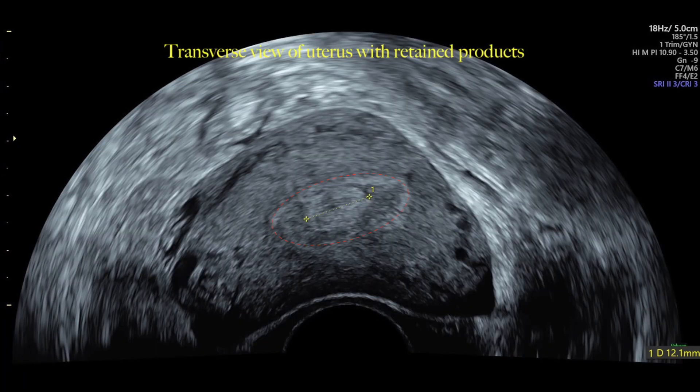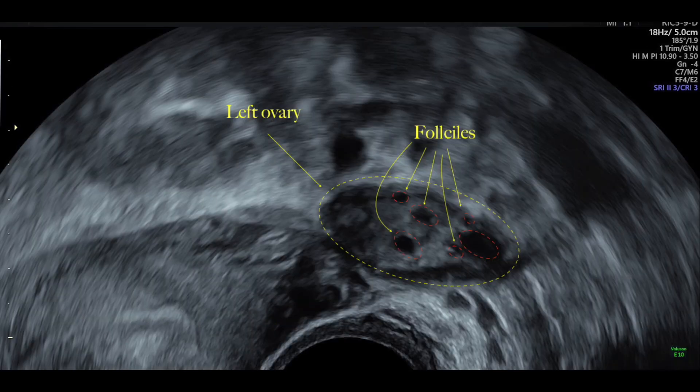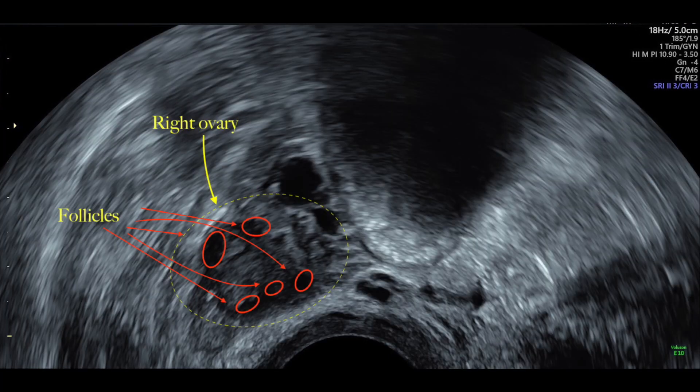This is the transverse view of the uterus showing a hyperechoic retained product. This is the left ovary with follicles and no corpus luteum, and this is the right ovary with follicles and no corpus luteum.